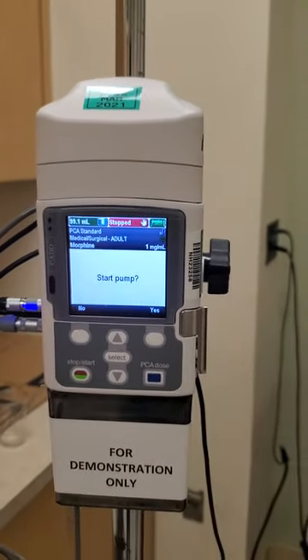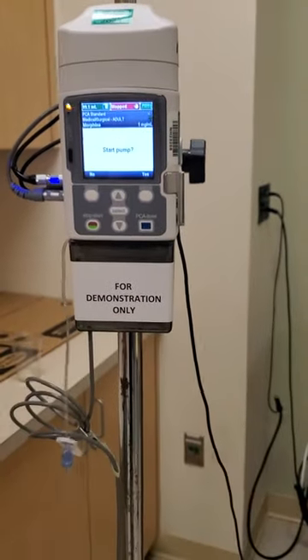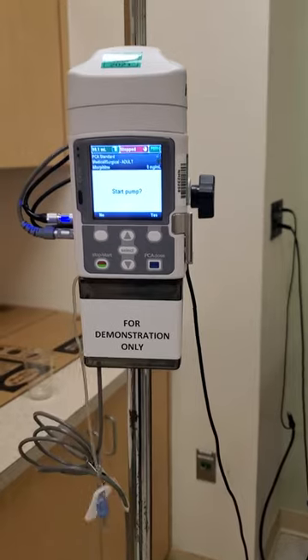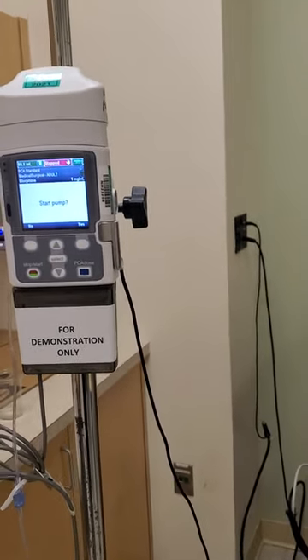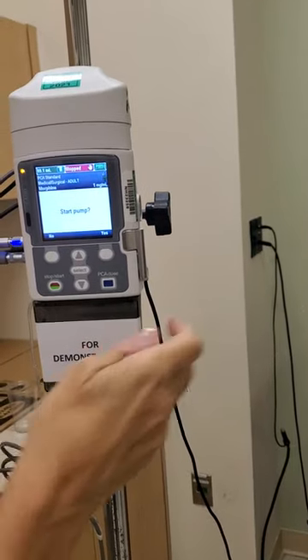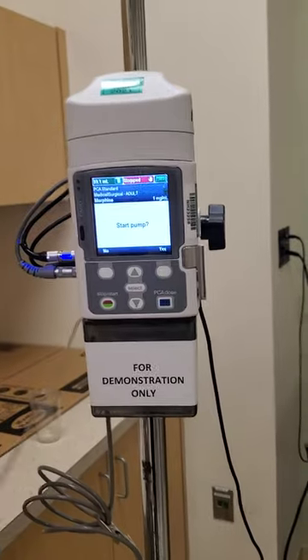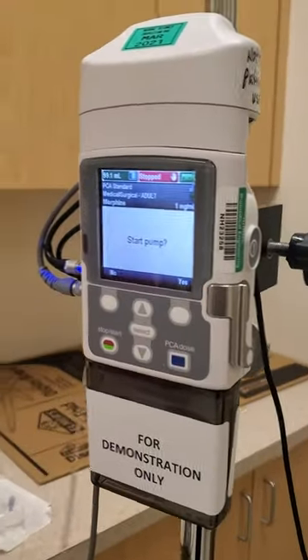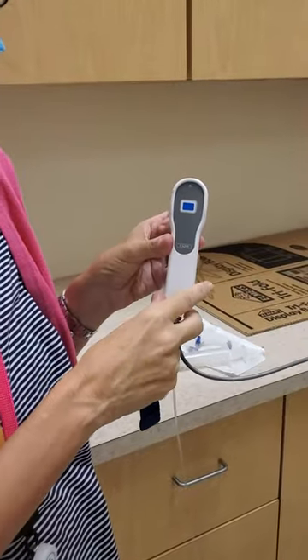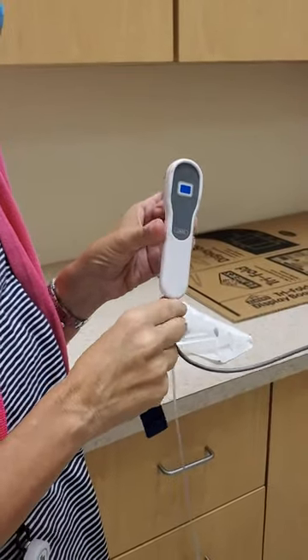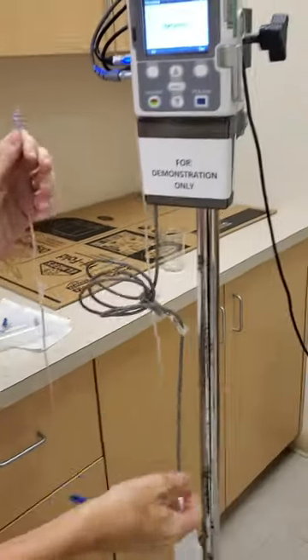Now I'm ready to start the pump. I would go ahead and connect this to IV fluid running at a slow KVO rate and then attach it to the patient, double-checking my order and making sure the patient is ready to use it. I would also instruct the patient on using the button, making sure they know this button is only for them to push — nobody else. You want to educate them on using this device as well.